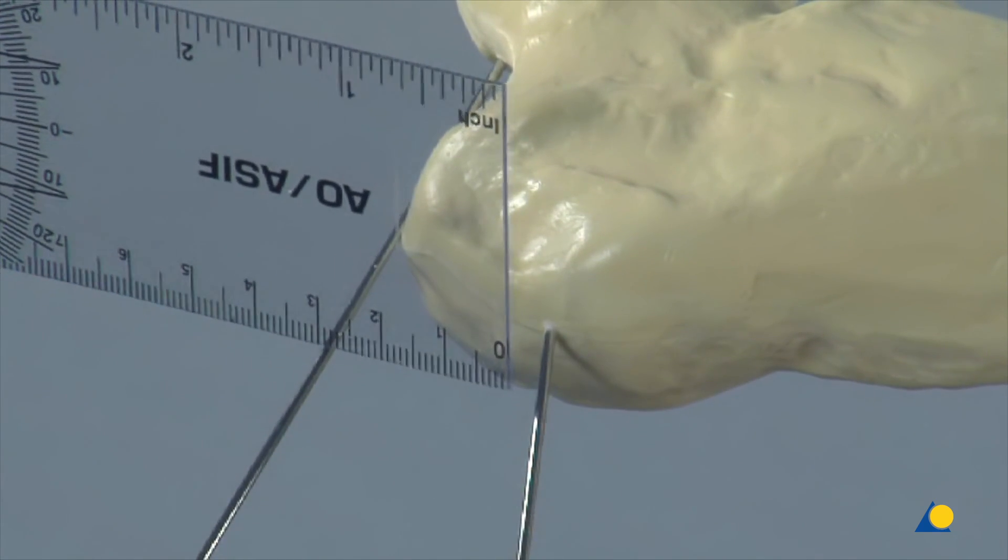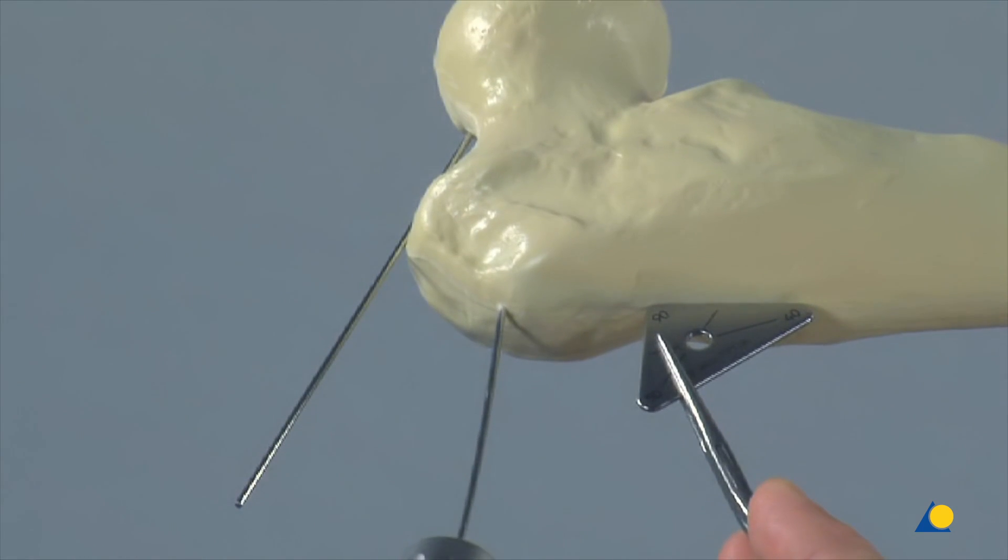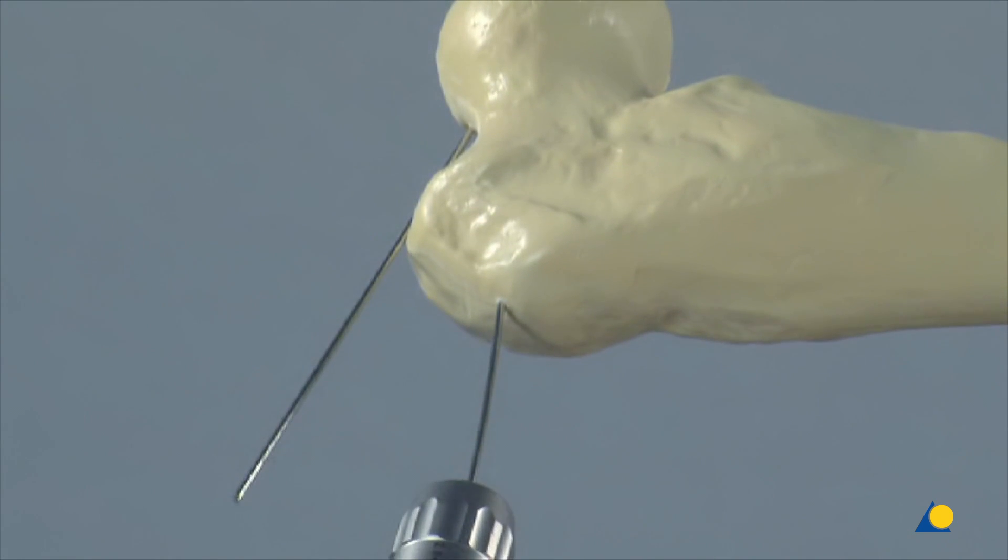A second K-wire is inserted into the trochanter, proximal to the site of the seating chisel window in the anterior portion of the femur. This K-wire should be parallel to the first in the axial view.